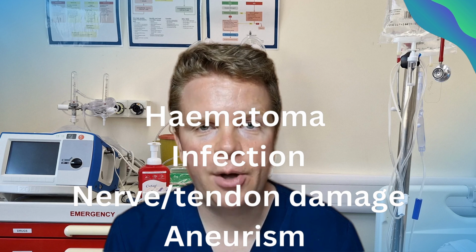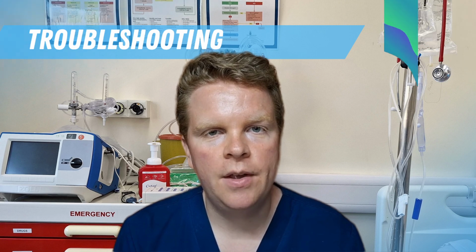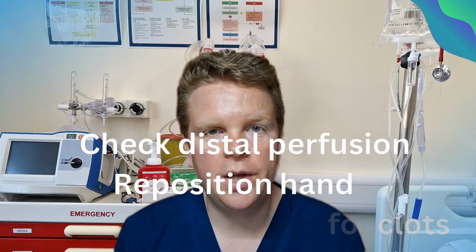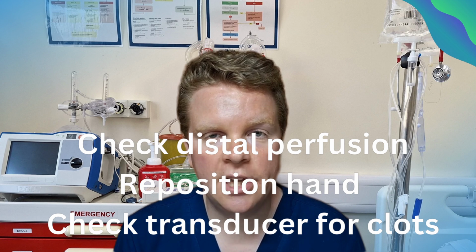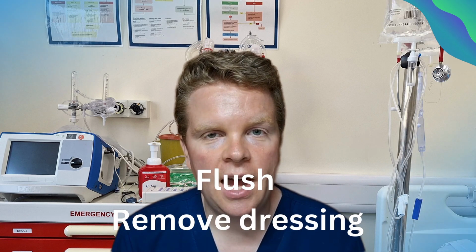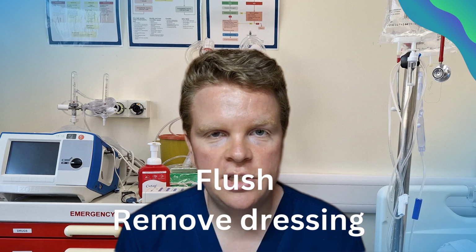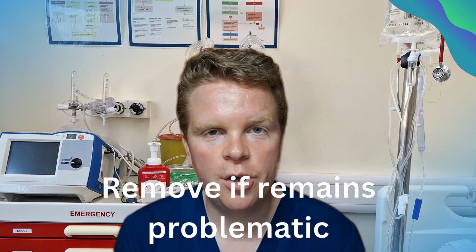If you have any doubt about an arterial line, take it out. If the line isn't bleeding back well or the blood pressure tracing isn't working, first check distal perfusion is okay. Reposition the hand and check that there are no visible clots within the transducer. Flush the line and consider removing the dressing to ensure it's not kinked. If the line remains persistently problematic, it is better to remove it before more severe complications occur.